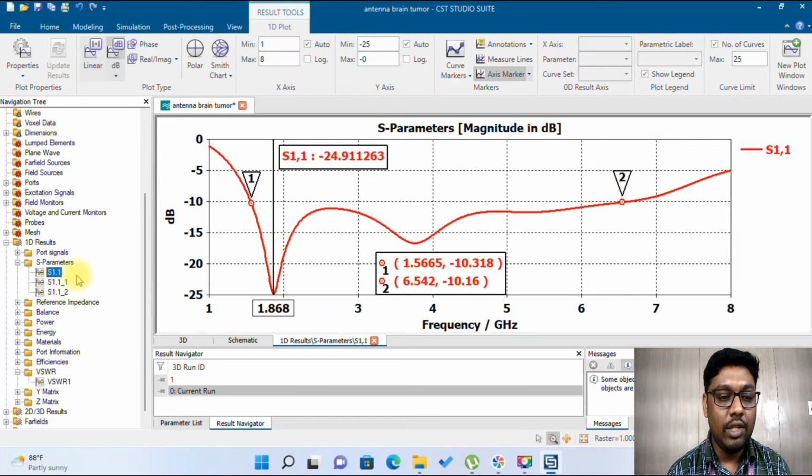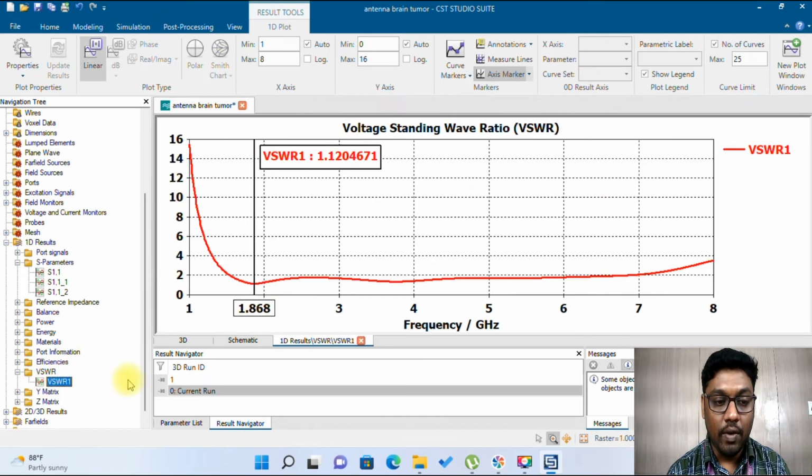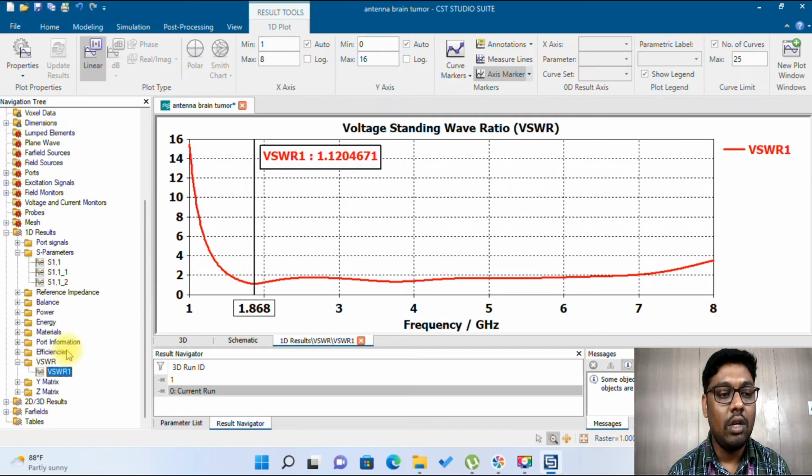So here you can mention that the resonant frequency is around 1.8 gigahertz. And once we look into the VSWR at the same frequency, that is 1.8, that is your resonant frequency. You need to check the VSWR value, and theoretically the VSWR value is equal to 1, or it could be less than or equal to 2. So it is satisfying, 1.1. So the antenna is a good antenna, the design is good, you can use it for this particular application.